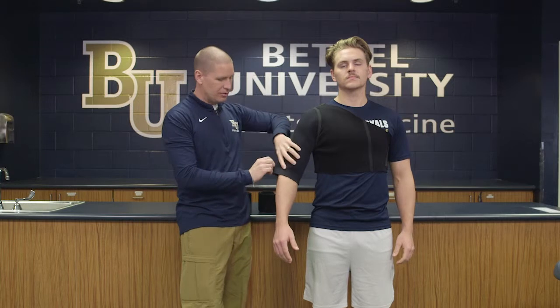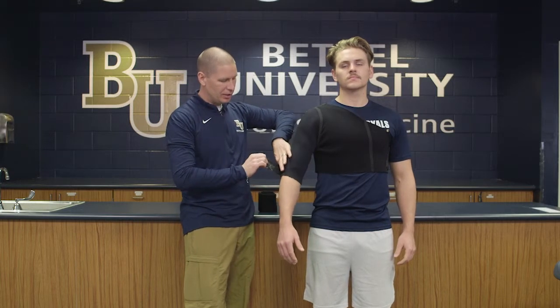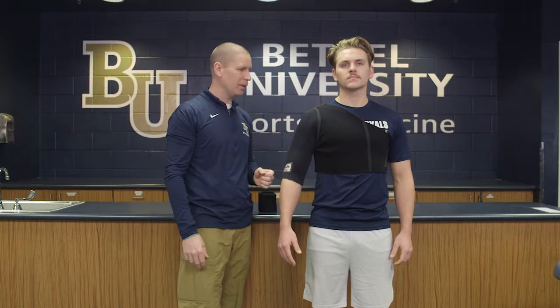There's also a velcro strap here, so if you want to secure it onto the arm just a little bit tighter, you can do that.